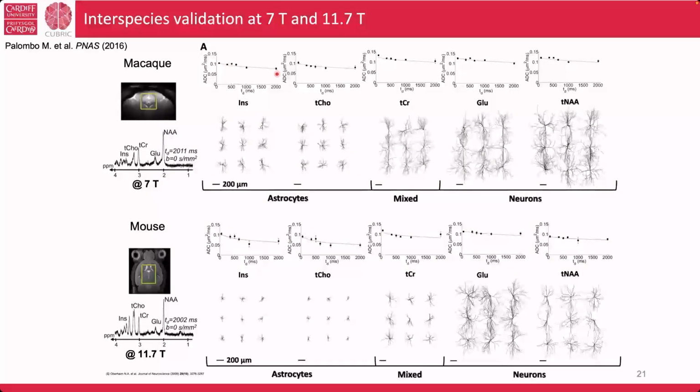And we have done it for different molecules. So with diffusion MR, we can not only use water, but we can also use other molecules. We can encode the signal from other molecules other than water. Why is this convenient? It's convenient because some molecules, such as N-acetyl aspartate, are mostly inside neurons, while inositol or choline are mostly inside glial cells.